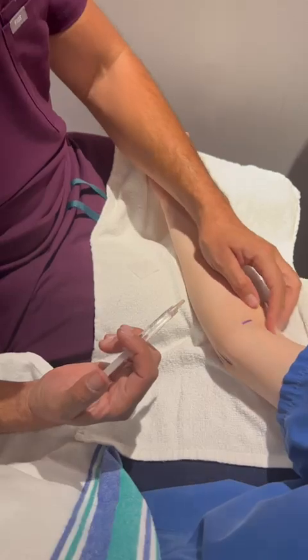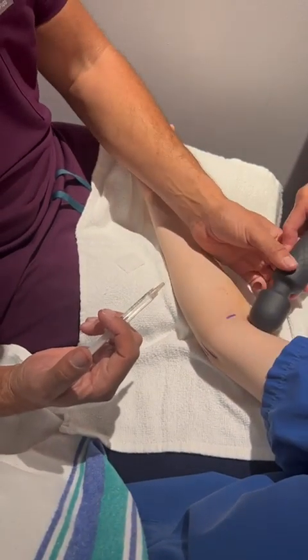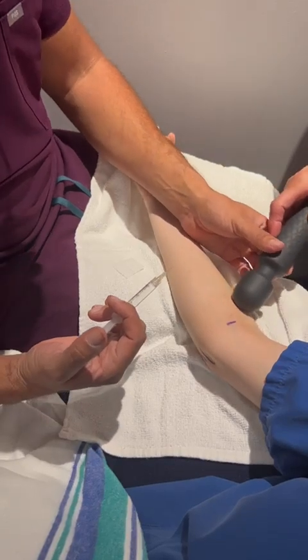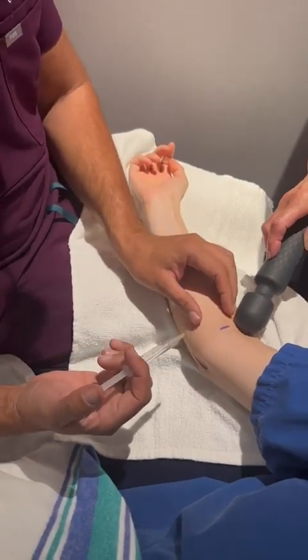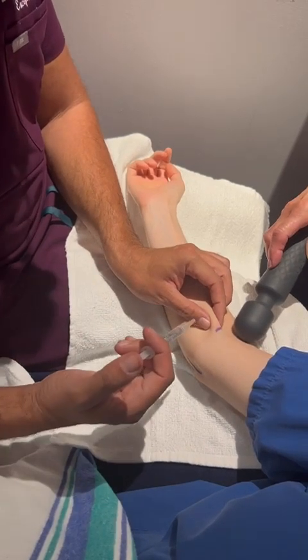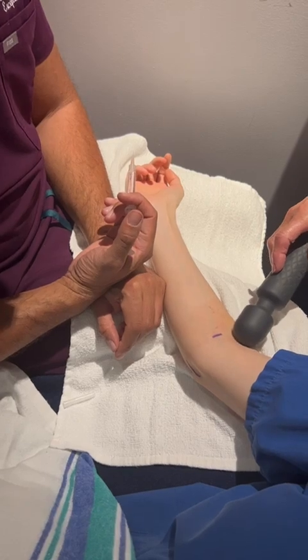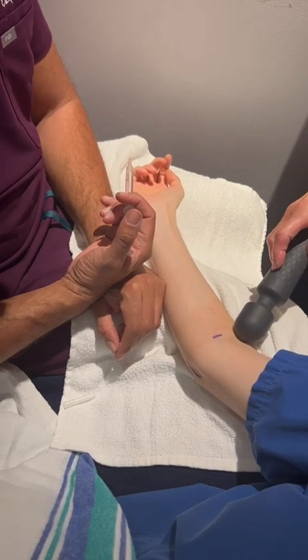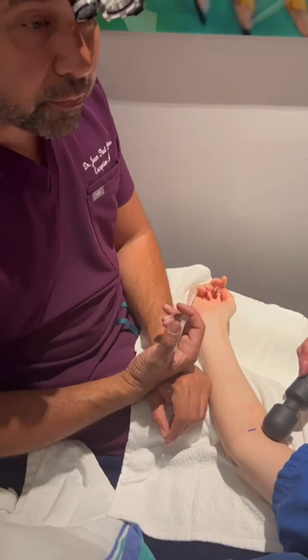We're going to apply some dynamic vibration here, which acts as a distractor for the brain — it takes away your brain's attention from what we're going to be doing. Then I'm going to pinch you three times, poke you, and ask you to give me a pain score from zero to ten. Zero meaning absolutely no pain; ten would be the most horrible pain you've ever felt.